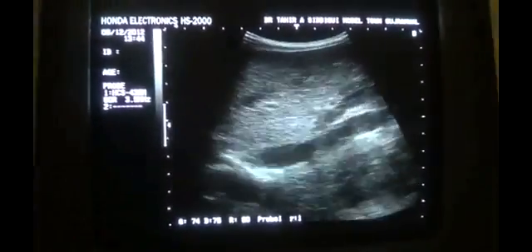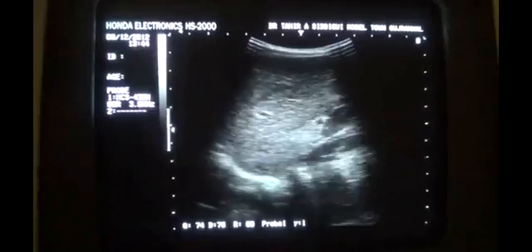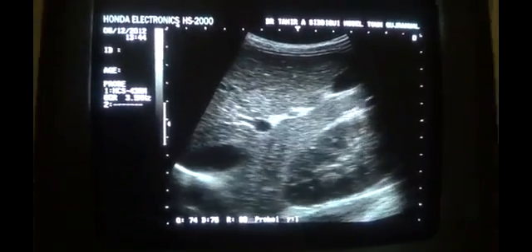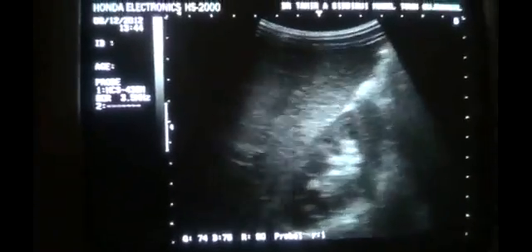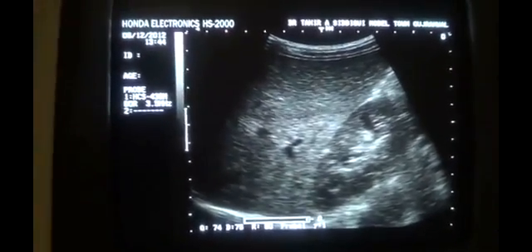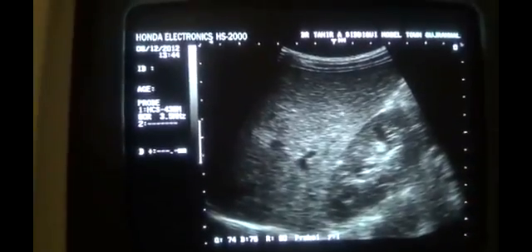So, can we say that the liver is enlarged minimally? Now, one thing to be very clear about is to compare the liver with the kidney and see if the liver parenchyma is normal or diseased, whatever the case may be. In this patient, the reason we are seeing the liver minimally below the costal margin is that he is a thin, lean child, and in such cases it's not unusual to find the liver below the costal margin without any pathology relating to the liver whatsoever.